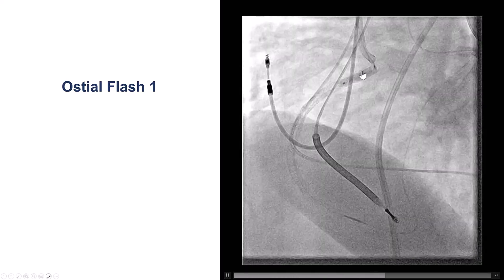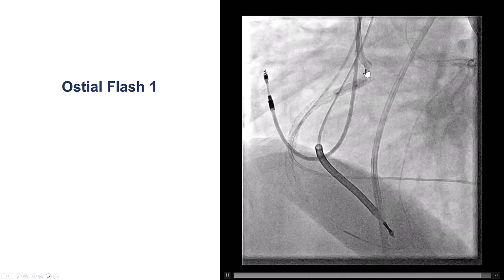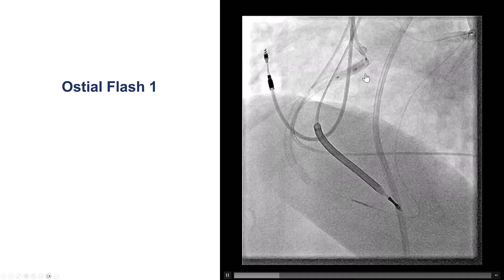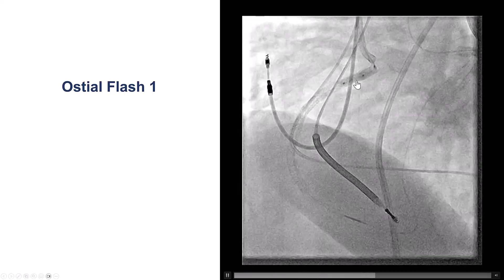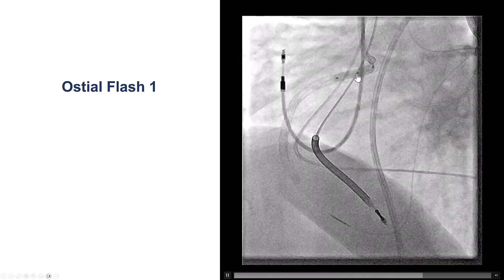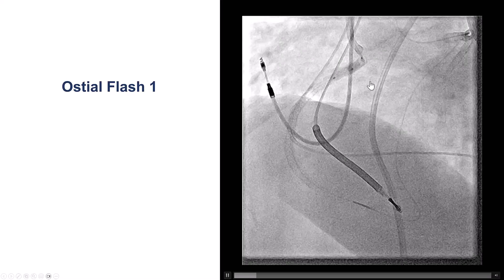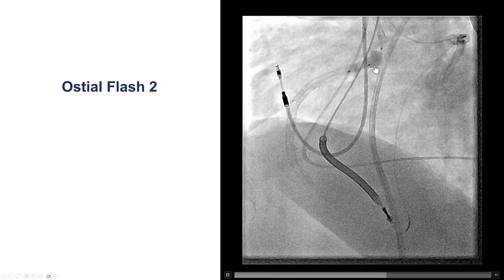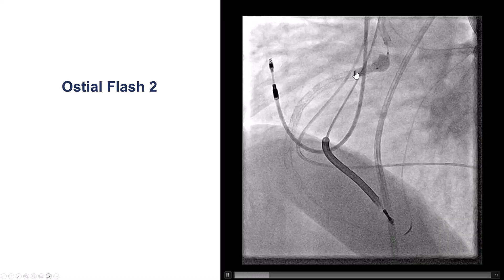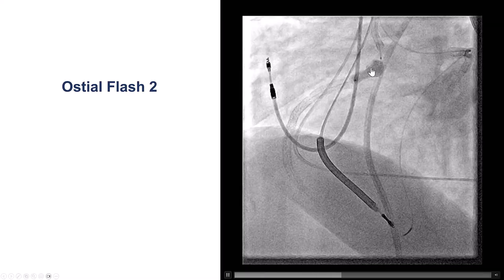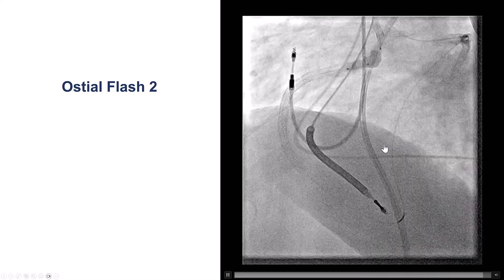We then wanted to flare the ostium because it was quite challenging to engage the RCA. As we remember from the CT, it was an anterior take-off. This was the ostial flush balloon. The ostial flush was too deep here, so we pulled it back a little bit and now we have nice flaring of the ostium. We have the anchoring balloon in the right position, and the larger balloon is essentially pushing the stent struts against the wall of the aorta.